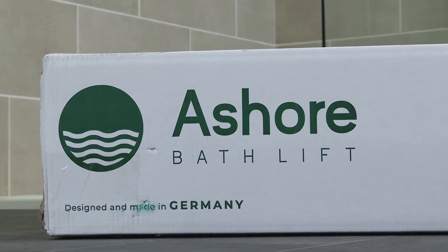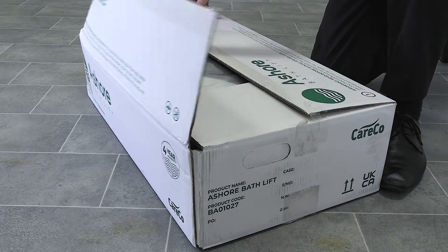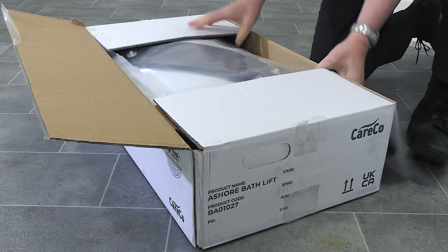Your Ashore Bath Lift should come fully boxed as seen here. Courier delivery is available straight to your doorstep. Carefully cut the tape with a knife or a pair of scissors to open the box. Please take care to avoid scratching the items inside.